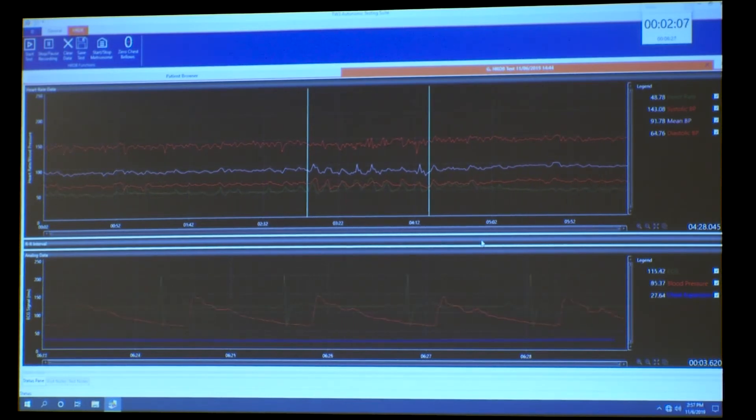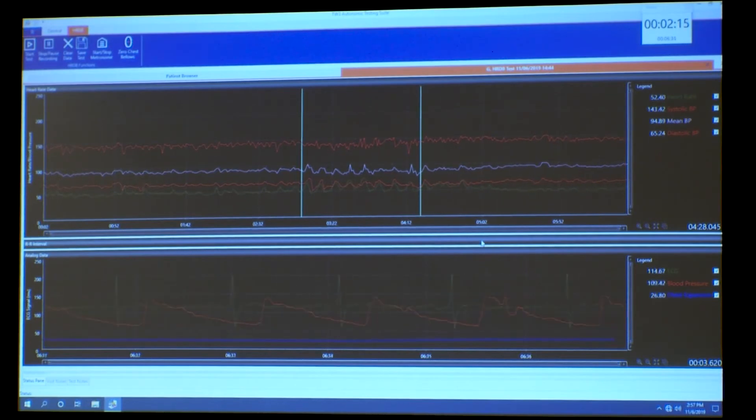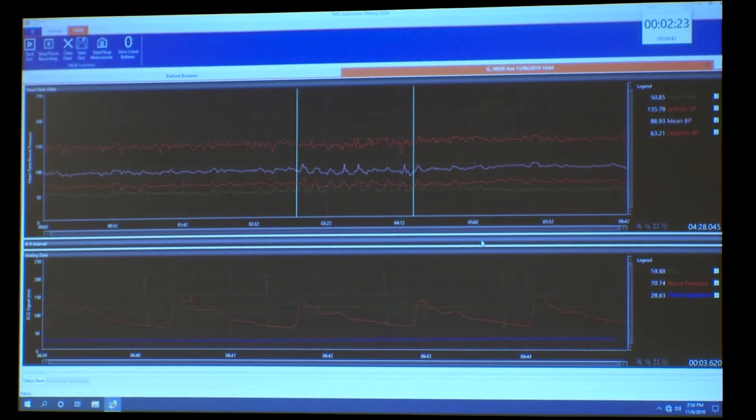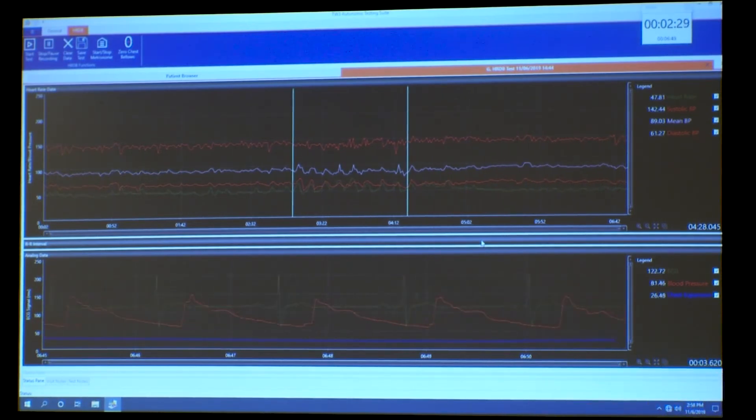These baselines are also very important. Some people try to make them a little bit shorter, but we find that we want to make sure we're standardized so everybody is going through the same amount and has the same wait periods.